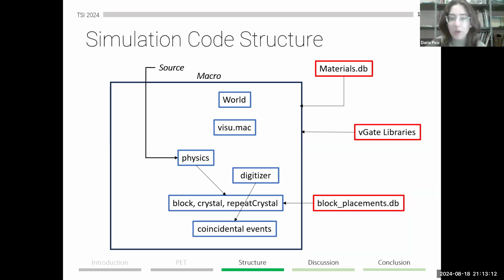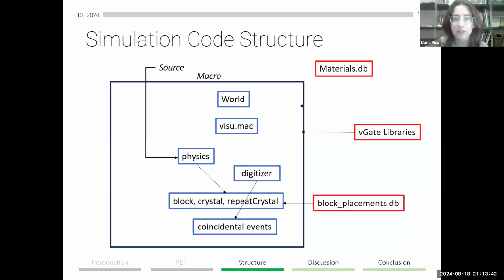These parameters are all imported from the GATE libraries. The simulated outputs include coincidental events, energies, and detection position, which are going to be used in our reconstruction, and we set the timing window to 10 nanoseconds with min sector difference set to 1. This means that for a successful event, the two singles have to be separated by at least one block. That means that they just can't be detected by the same block. We also set an offset of 500 nanoseconds to account for any insensitivities in the detector layer.